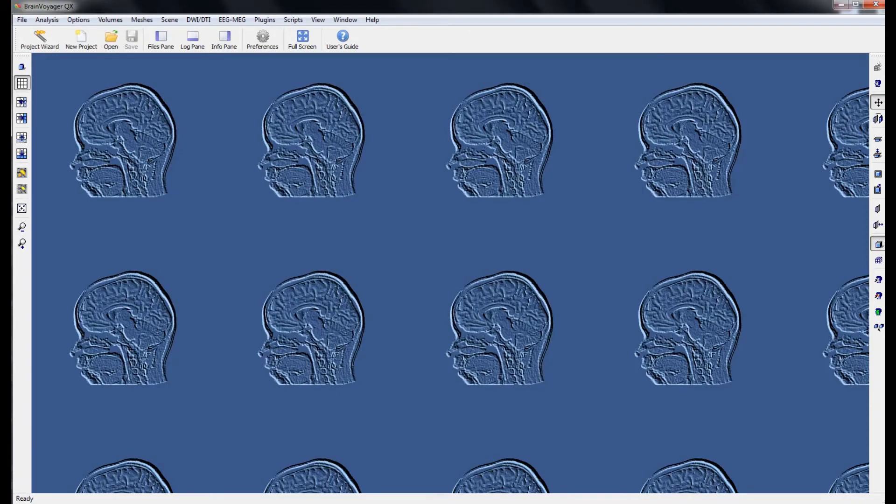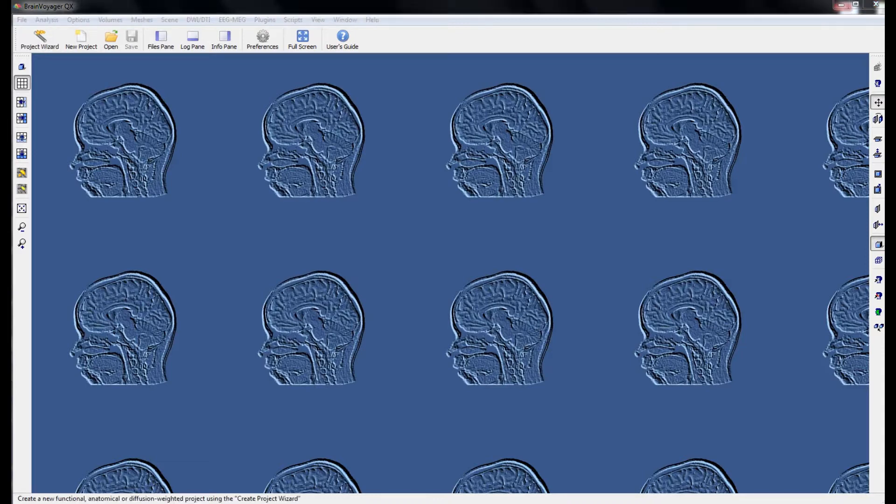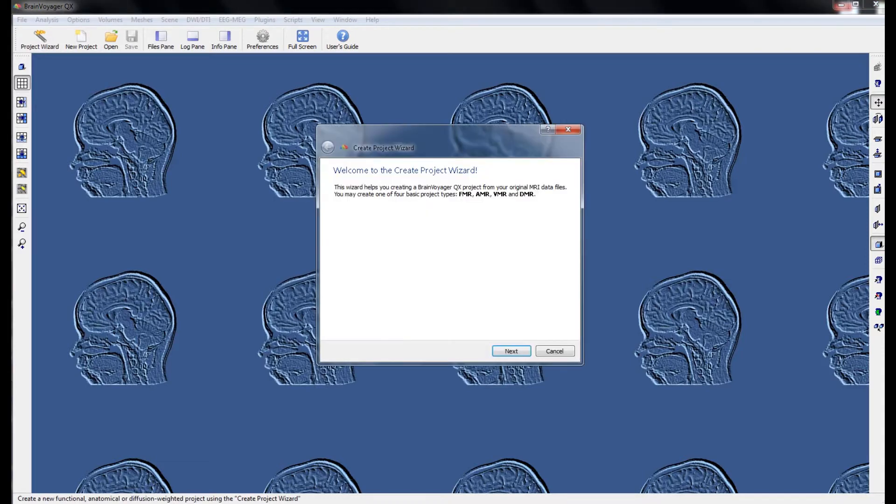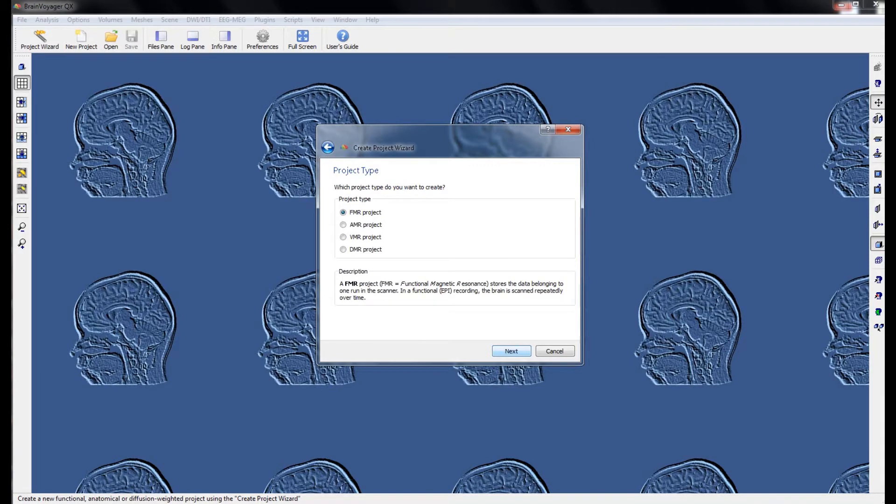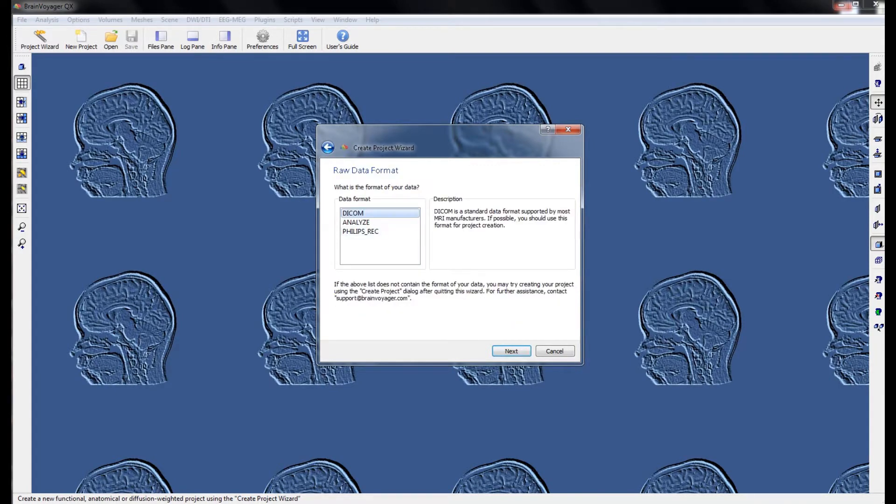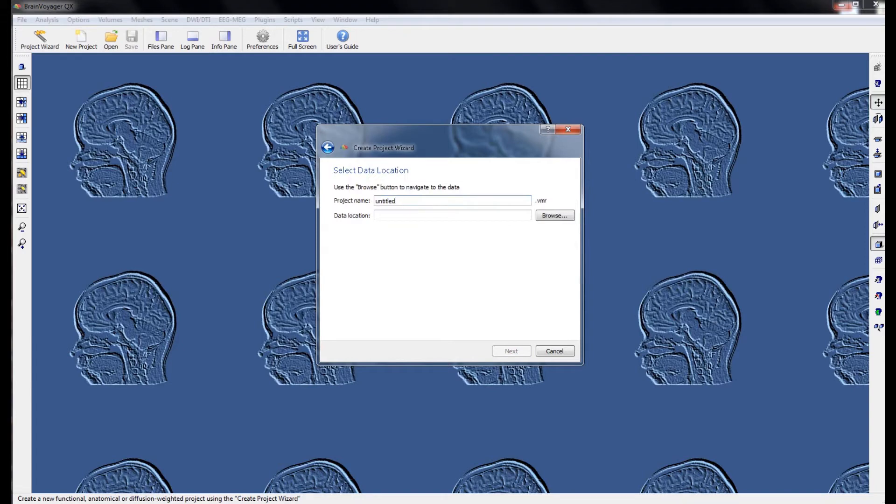Our goal is to reconstruct from the DICOM files the anatomical we collected in the scanner. To do this, we want to use the project wizard. From the project wizard, we want to select the option to create a VMR project. Here we want to choose the DICOM file format.